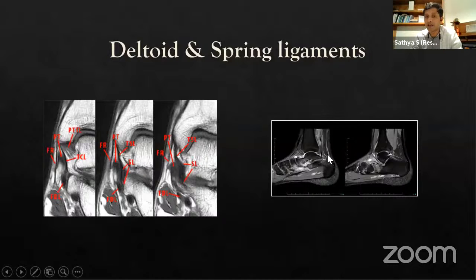You're able to see the posterior Achilles bursa. Then we can see a bit of retrocalcaneal bursa that is present here. Then Kager's fat pad that is present in front of the Achilles. Then we are able to see the lateral process of the talus, the dome of the talus, the neck of the talus, the body or the head of the talus, the navicular, the medial cuneiform, the tibia, the presence of the plafond, and how the dome is articulating there.